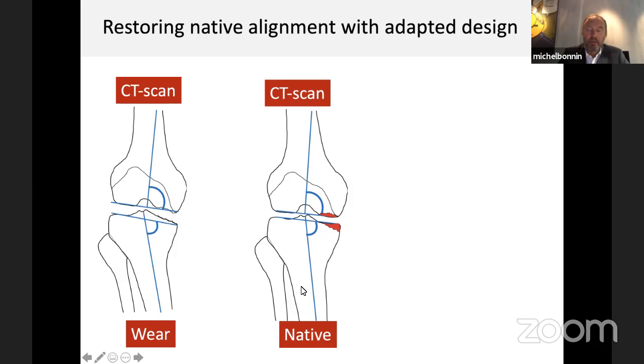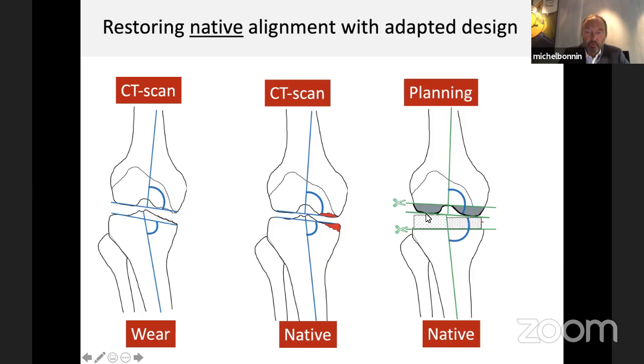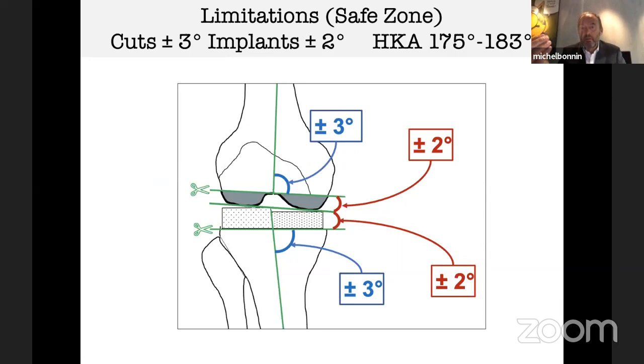And then the prosthesis is planned from that, in order to reproduce the constitutional alignment of the patient. And then we define the orientation of the bone cuts and the inclination of the polyethylene. And our rule for now, perhaps it will change in the future, but because we didn't want to go into a dangerous adventure, we try to follow the accepted rule in that field.